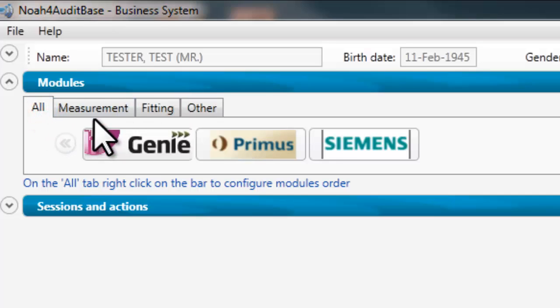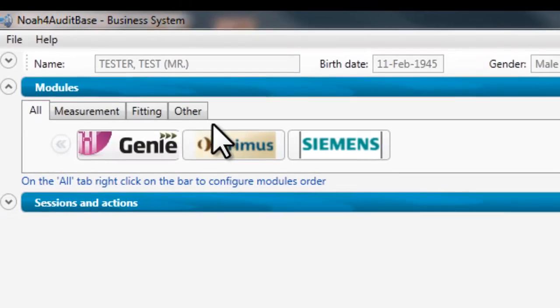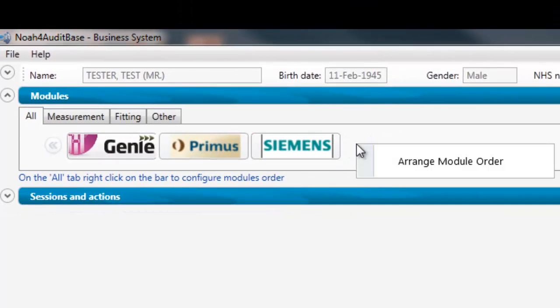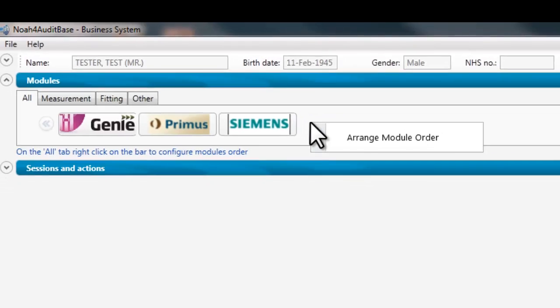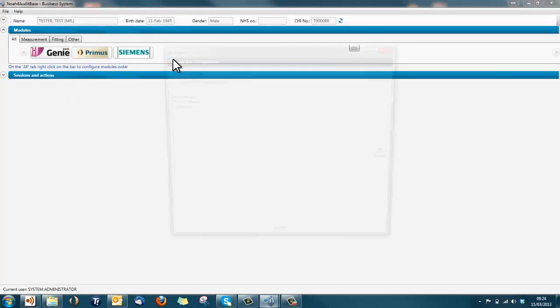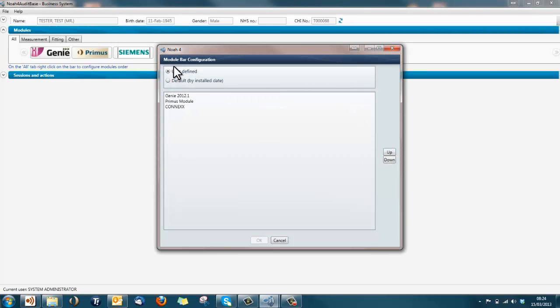Each user can change the order of module logos to their preferred order. Right-click on the modules bar while the all tab is selected. Click on arrange module order and the module bar configuration window will open.